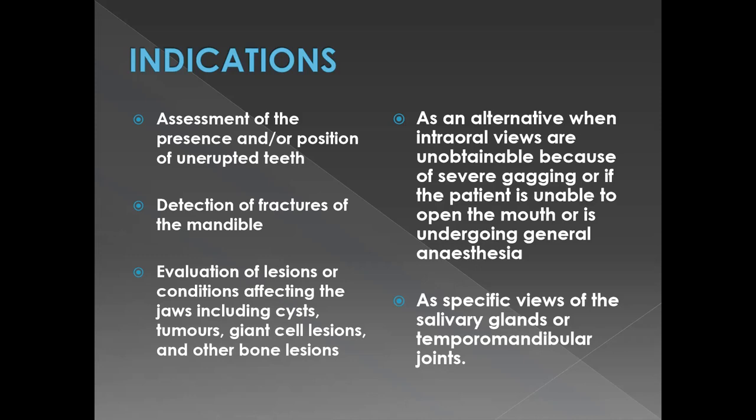So if you've put in a plate, for example, and you just want to be sure that everything is in position, there's no flaring at the lower border or anything like that, and you don't want to wait for the patient to wake up, go to recovery, and then order the OPG once the patient has fully recovered, and then God forbid your fixation and reduction was not appropriate, you'll have to take the patient back to the operating room again. So this is something you can do per op. Lateral obliques, etc., you can do while the patient is asleep under general anesthesia.